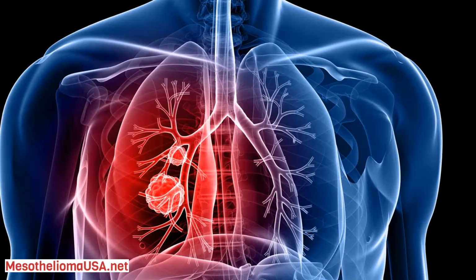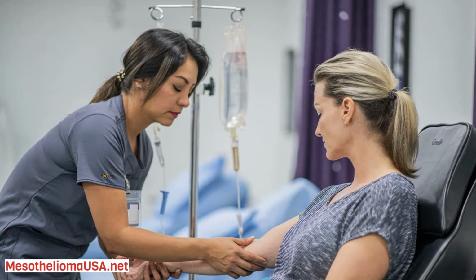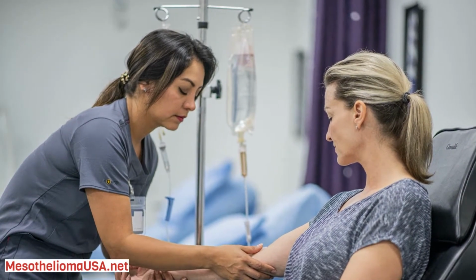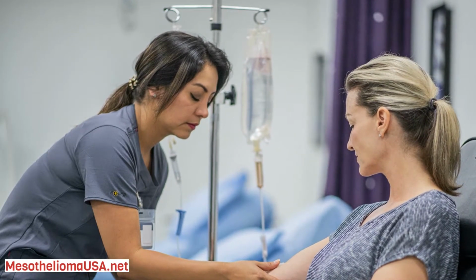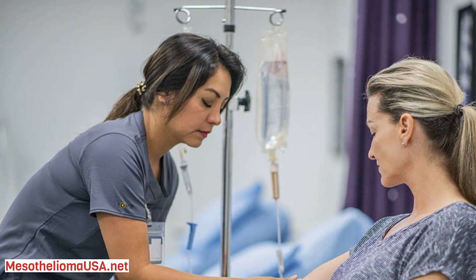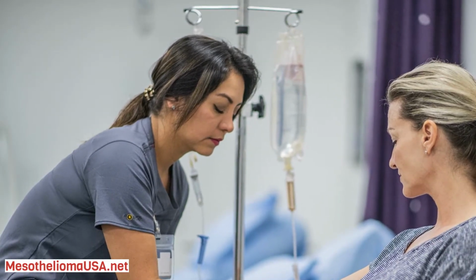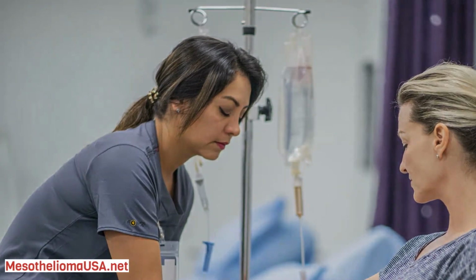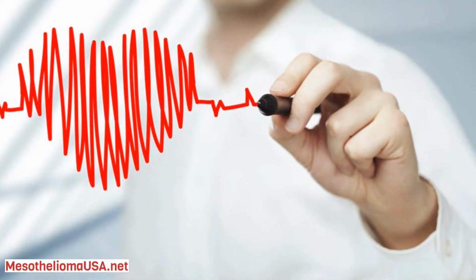Among all 55 cases, the most common finding was pleural thickening, 70.9%, N equals 39, followed by free pleural effusion, 60%, and parenchymal infiltration, 56.4%. Based on pathology, we divided our cases into two groups of malignant mesothelioma, 17 cases, and metastatic carcinoma, 38 cases.